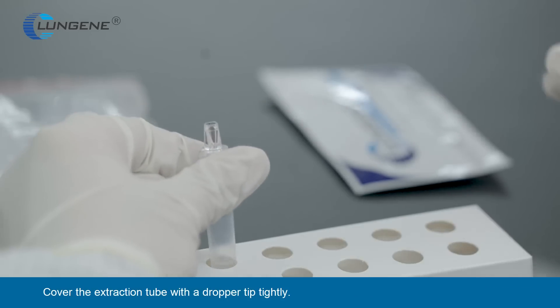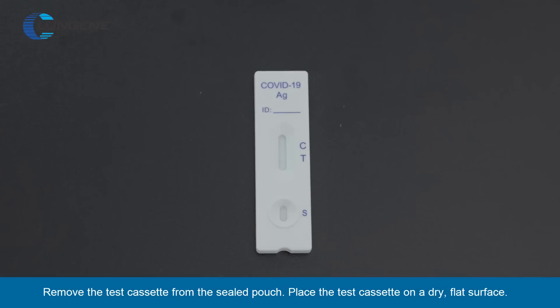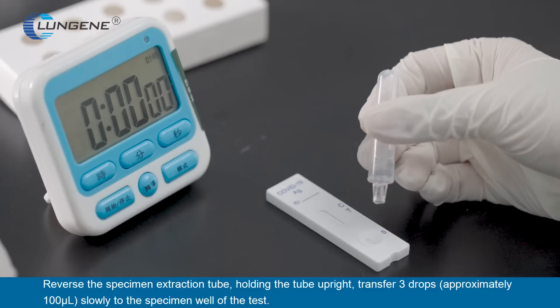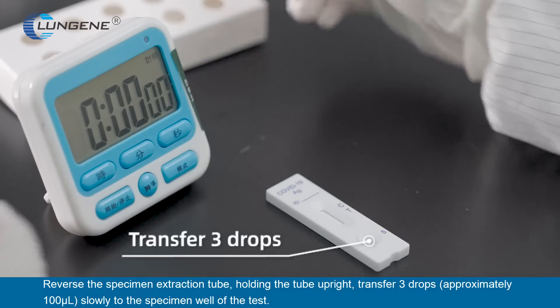Cover the extraction tube with a dropper tip tightly. Remove the test cassette from the sealed pouch and place the test cassette on a dry, flat surface. Reverse the specimen extraction tube, holding the tube upright. Transfer three drops (approximately 100 µL) slowly to the specimen well of the test.